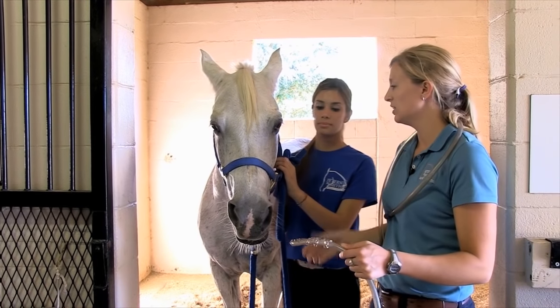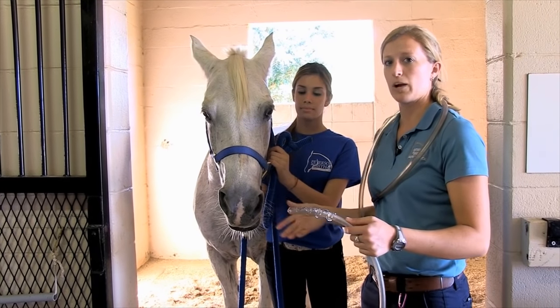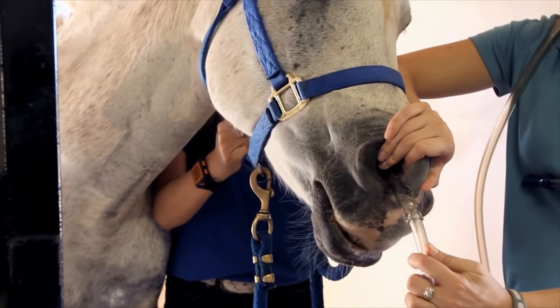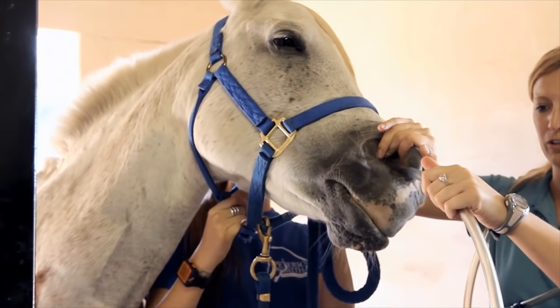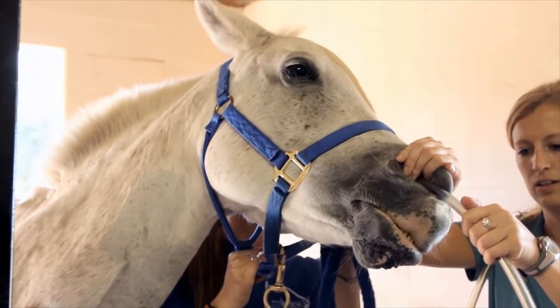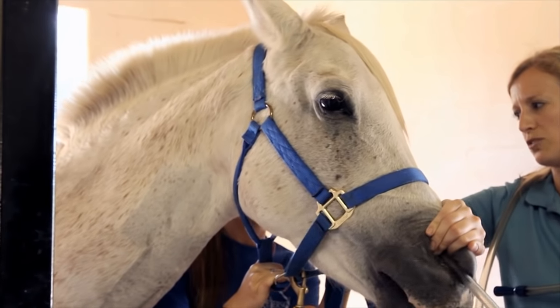You can see that my handler is pulling her nose down and flexing her head, which gives you a better shot of going into the esophagus. If their neck is extended you'll go right into the trachea. I slowly start passing the tube, using my middle finger to push the tube down, and as you're passing it always feel for any resistance — you may need to redirect. Once you're at the pharynx, watch their throat and watch for them to swallow.